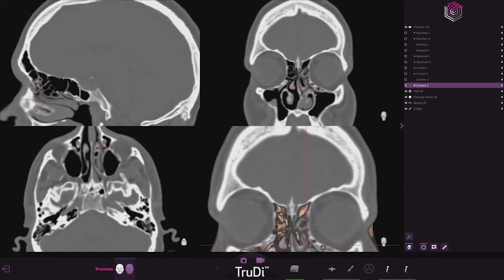And so what we're able to do is to set planning points and radio beacons. What the planning points do is allow us to select, yes, this is the area we want to be in, or you can see as I push the right button, there's a green and a red dot. The red would be something I want to avoid. For example, if I saw a dehiscent carotid artery or a dehiscent anterior ethmoid artery, I would probably mark that with red. I could go ahead and mark the orbit and the brain in red too, but I'm not going to do that today.